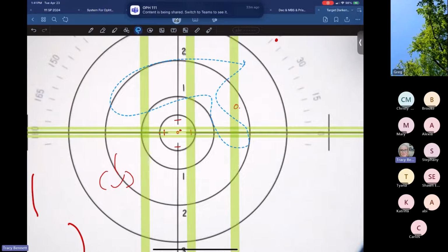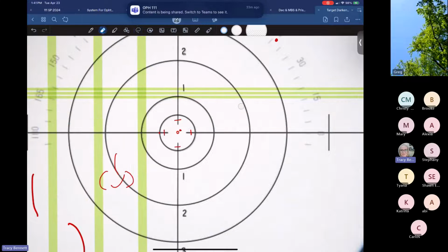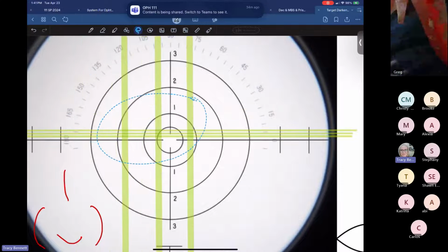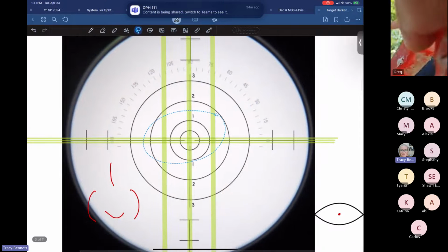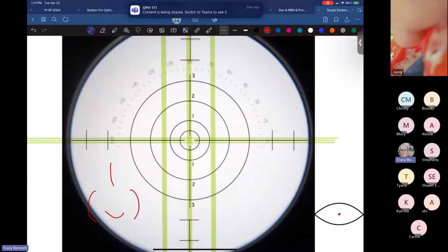I do think that for the exam, we don't focus on that quite as much until the beginning of next semester when we get into working with unwanted prism in the lensometer and wanted prism. All right. Here's the other way, though, that you might need to do this. You were reading the amount of prism that's displayed on the target. And I believe that's what you'll be doing on your exam.